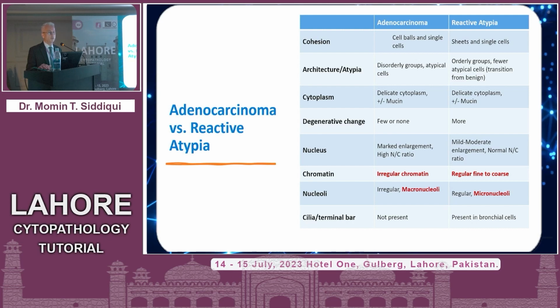It's a nuclear stain. You can certainly make a call of a primary lung adenocarcinoma. So how would you differentiate, say, adenocarcinoma from that significant reactive change that I showed you in that sample, which had been taken out, actually resected? I think one way of looking at these cases is to look at just the nuclear details. Those are the most common and most important ones that you should look for.